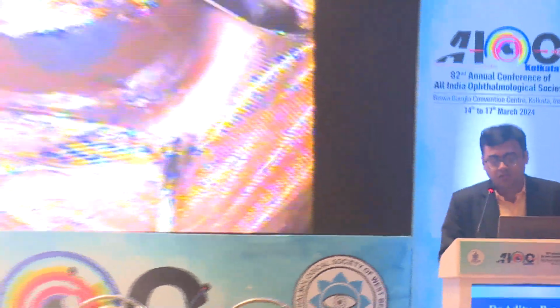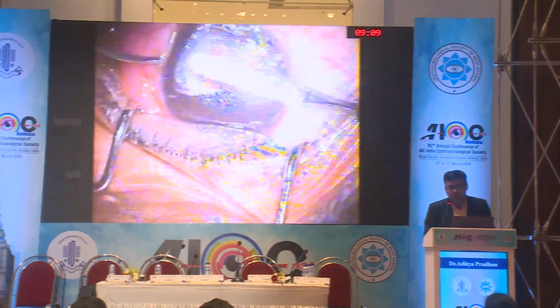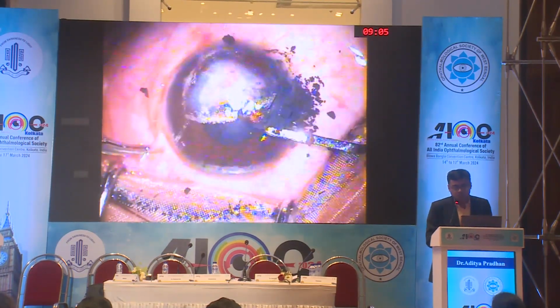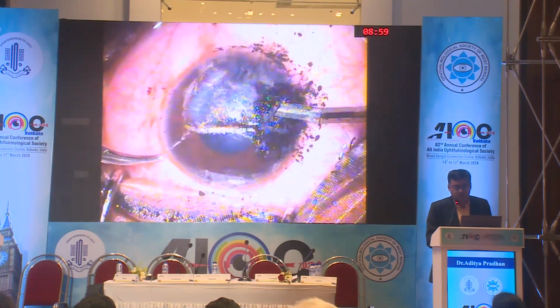I'll just show you a video. As you can see, there is this full thickness scar, and the surgeon is fashioning a lamellar pocket with a lamellar dissector above the level of the scar, but obviously some part will still be visible, and now the powder is being pushed into the lamellar pocket to achieve the desired cosmesis.